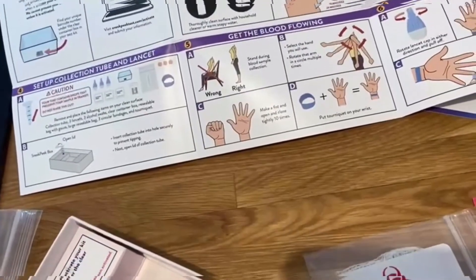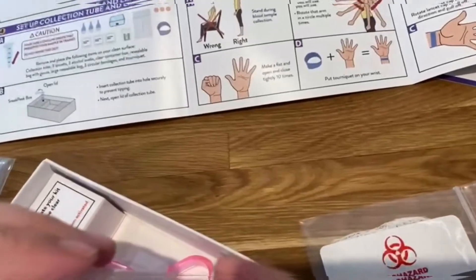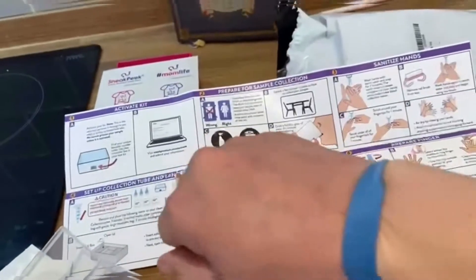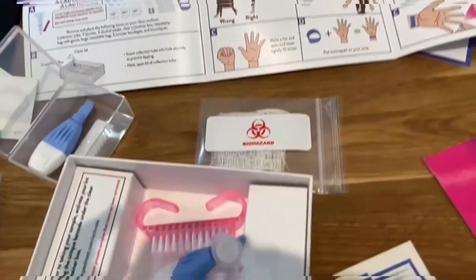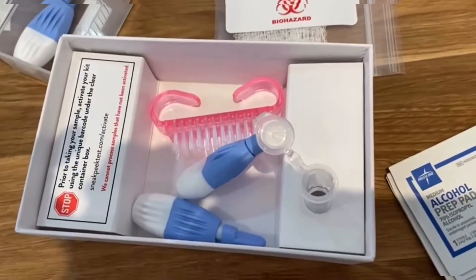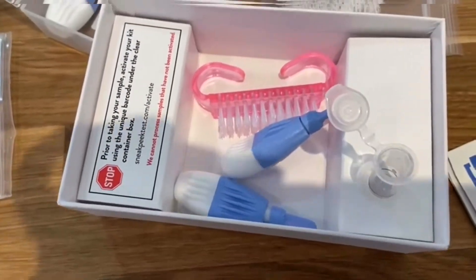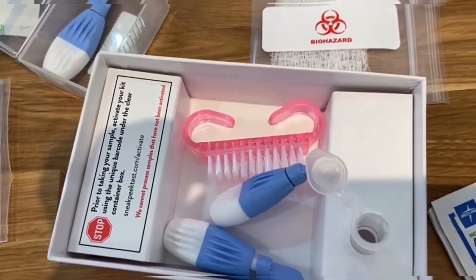I'm actually quite scared. I've put the tube in place, put my wrist strap on, and done that about ten times as instructed. Now I'm going to try my best to make my finger bleed with one of these lancets — let's see how it goes.